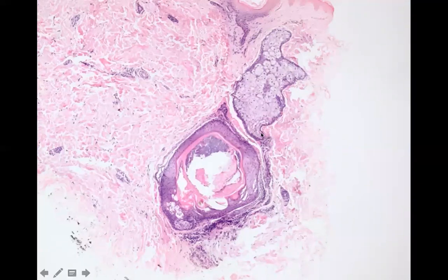So you have a dilated follicle that's filled with keratin. And if you look in here closer, which we will do in a second, there's sebaceous material, okay? You have sebum, keratin, and then a bunch of bacteria. The P. acnes bacteria that may or may not be pathogenic, but it's along for the ride. Surrounding your comedone, you just have a little bit of a lymphocytic infiltrate, okay?